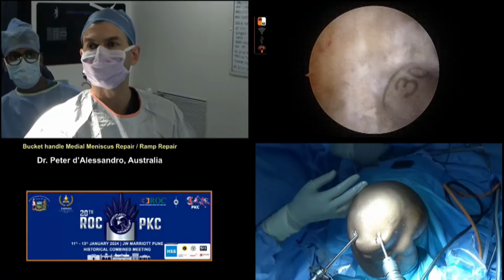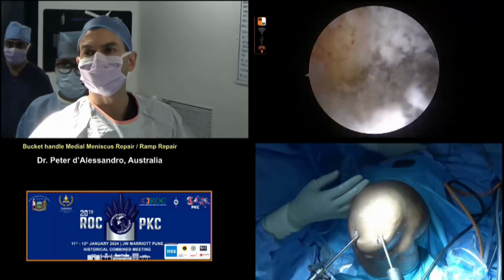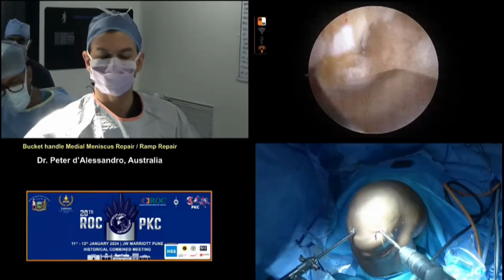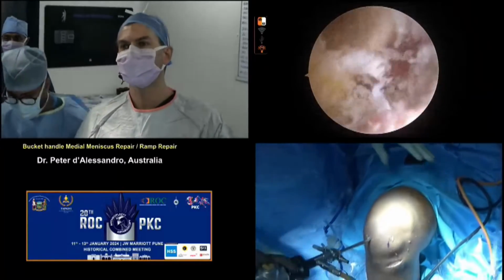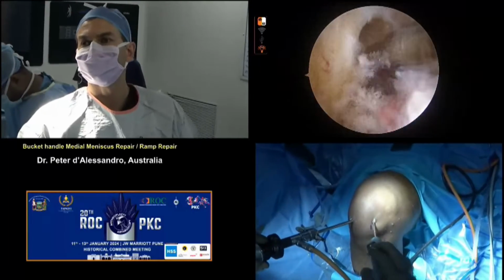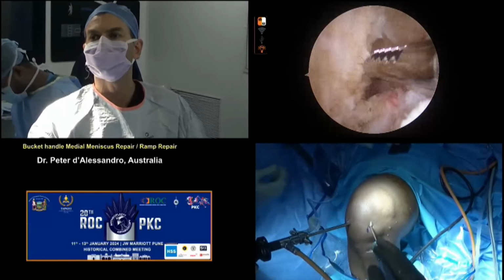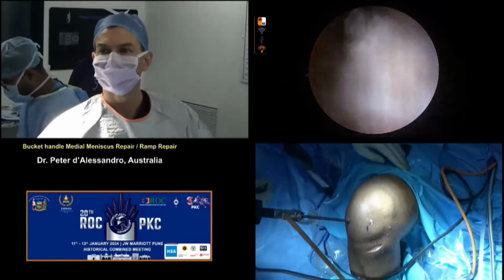The upside of adjustables is we can deal with a really short graft if we need to. Here we'll have 25 in the femur. Pull that all the way out, all the way. So again, I don't like putting the reamer in the knee with any sort of deep flexion, just out to 90 degrees. So 25 in the femur, we've got 25 inside the notch, and you can bottom out with an adjustable on the tibia, so you've got to make sure there's not too much graft in the tibia. So I'm happy with that femoral tunnel position right at the back.